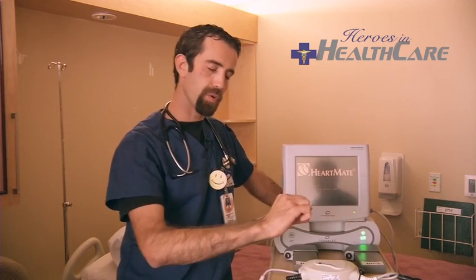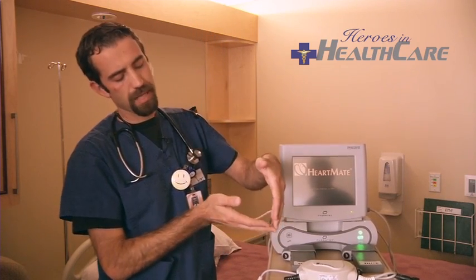So what we do is we put in the pump, an electromagnetically coupled jet engine, we like to call it, and it cores into the apex, or the pointy part of the left ventricle. It goes through the pump and then back up to the aorta, bypassing, if you picture the heart like this, if this is the left ventricle, it bypasses that left ventricle, which has become big. It doesn't squish well anymore. It just has a very small amount of movement and isn't perfusing the rest of the body. So basically that's the pathway of the blood.